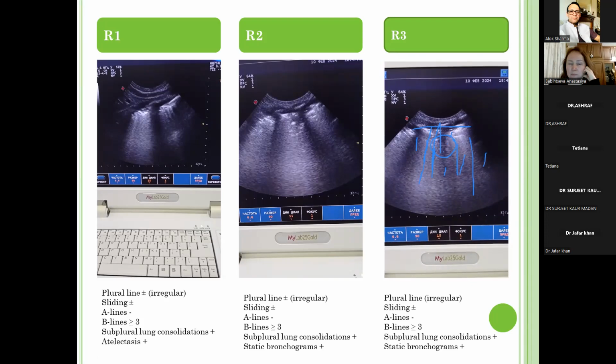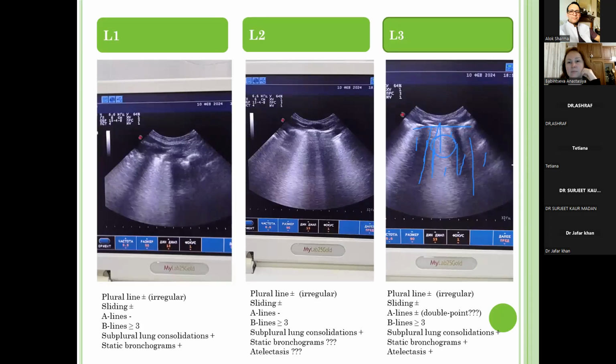But for me, with the history of meconium and this clinical presentation, the deterioration, the history that the baby's got, this would fit very much with meconium, especially with the patchy nature of the atelectasis. Again, lobar pneumonias and congenital pneumonias will usually be focal, and this is very diffuse. Please carry on.